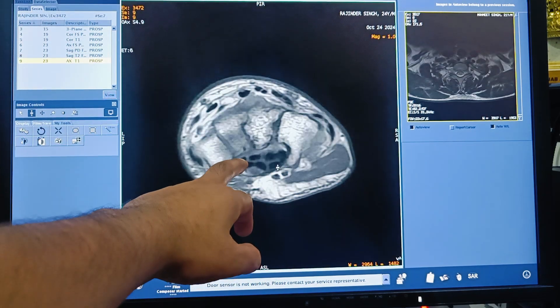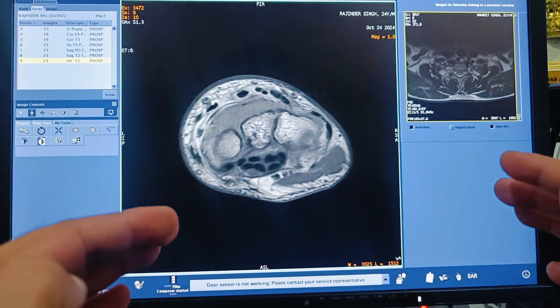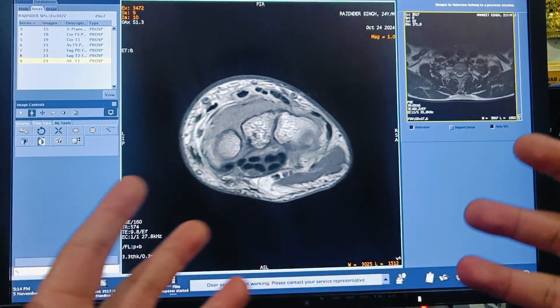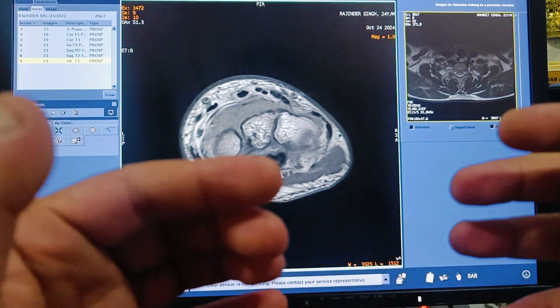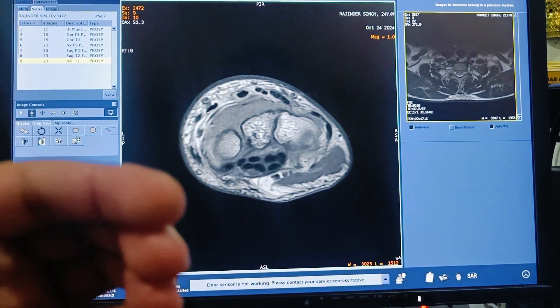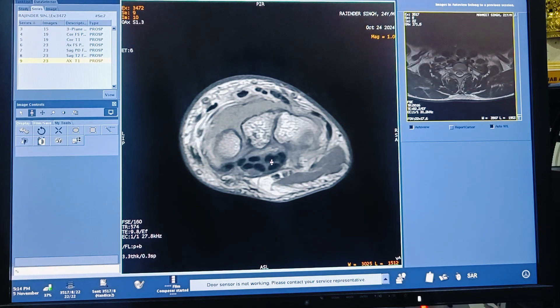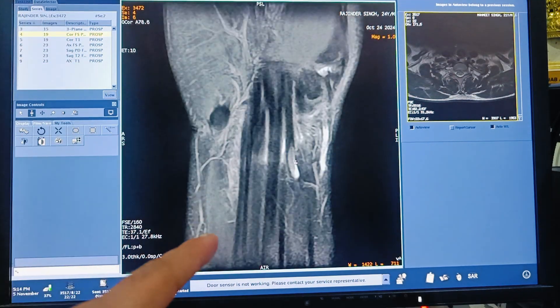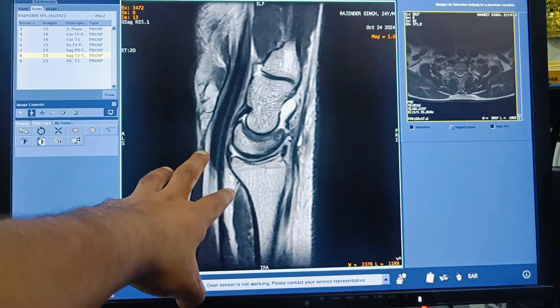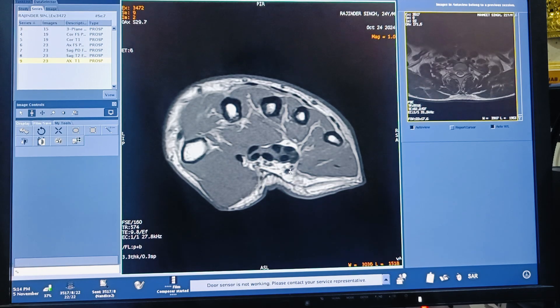The last sequence I acquired was an axial T1 weighted sequence. These are the common sequences for a wrist MRI study. The basic protocol includes: coronal PD fat sat, coronal T1, axial PD fat sat, sagittal PD fat sat, sagittal T2, and axial T1 weighted sequences. Additional sequences depend on the radiologist's requirements.